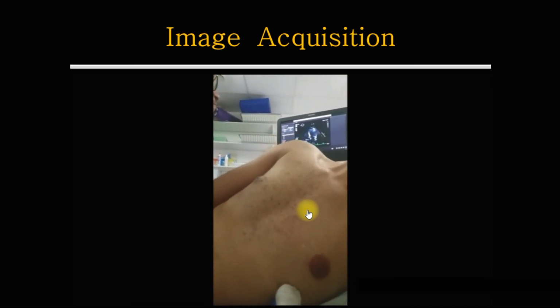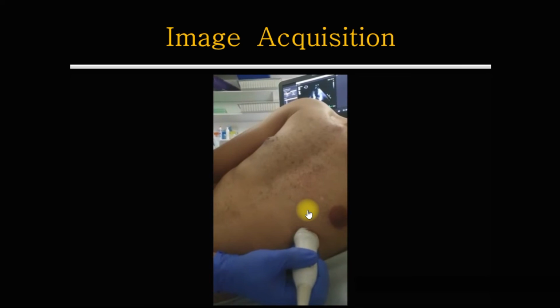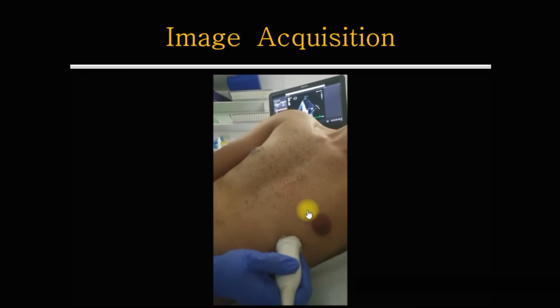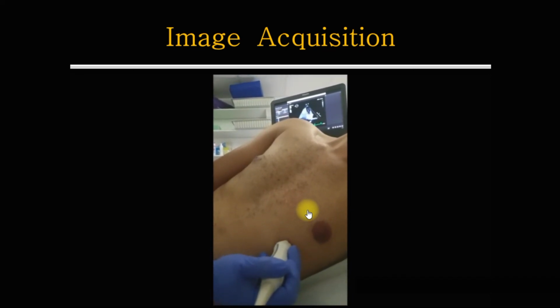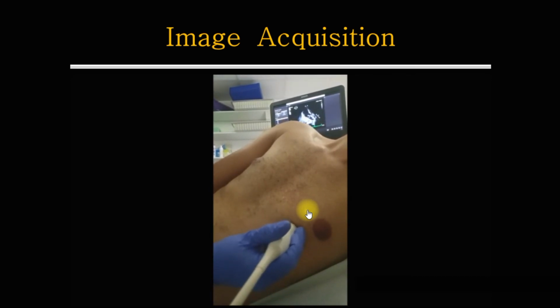Here is the apical 4-chamber view, almost just below the nipple, rotation of the markers towards 12 o'clock 2-chamber view, further rotation to get the 3-chamber view, almost 10 o'clock.